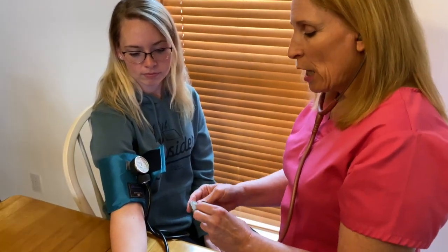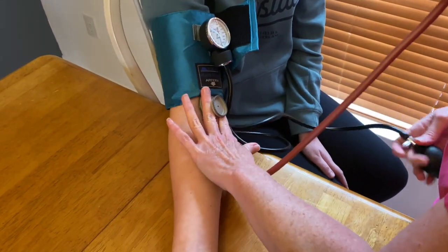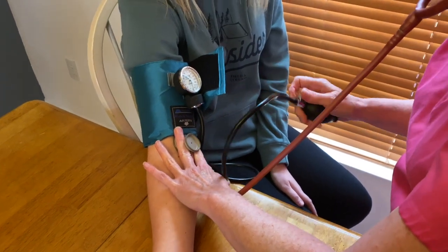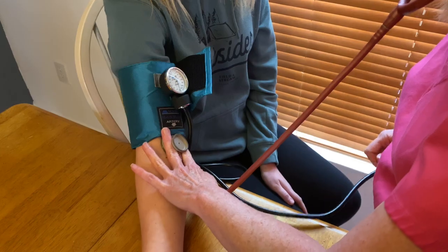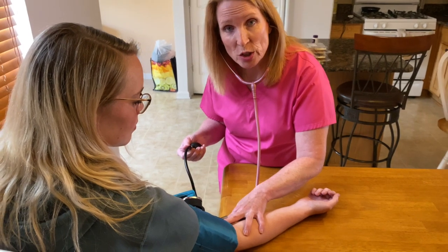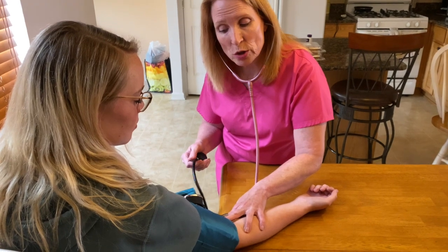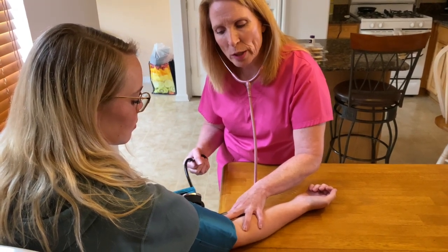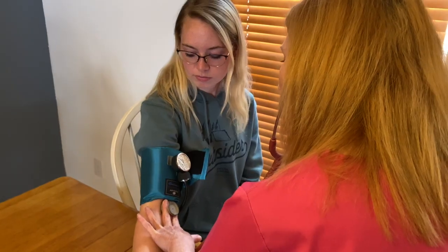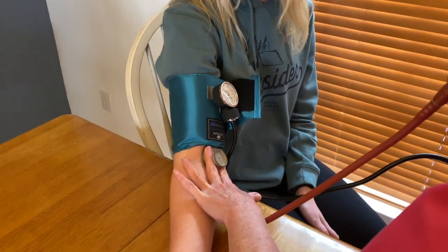So now I'm going to place my stethoscope over the brachial artery. I am going to roll up the bulb towards the patient. And notice that the patient's arm is nice and comfortably placed on a table, so it's just not dangling over. So I'm going to roll up towards the patient. Then, because I don't know her baseline, I'm going to pump this up to 160. I'm going to slowly deflate it, but not too slowly because I'm keeping in mind the circulation of the arm.